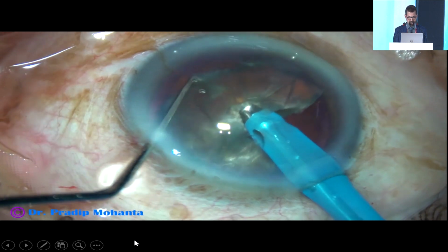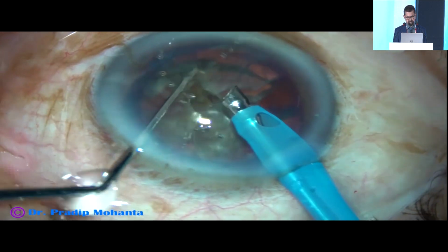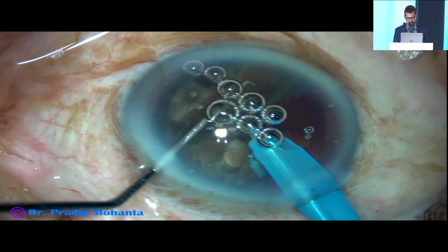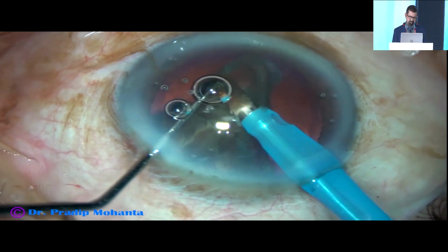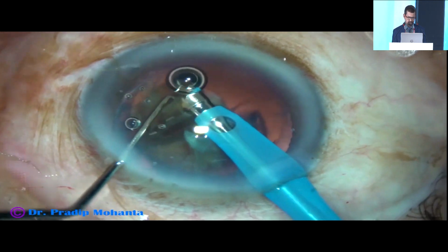And now this heminucleus is divided into 2 pieces and emulsification is carried on. See, some cavitation bubble formed. Immediately we have to use aspiration and remove those air bubbles. At this time, if we tilt the handpiece so the irrigating ports are directed towards the bubbles, the bubbles get moved and come to the aspiration port.